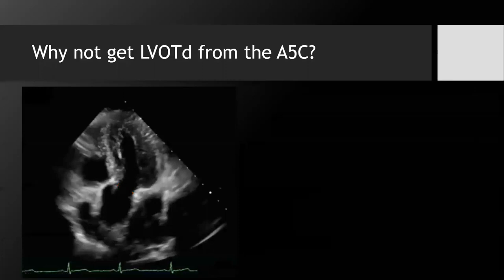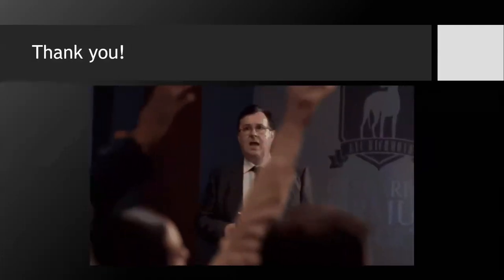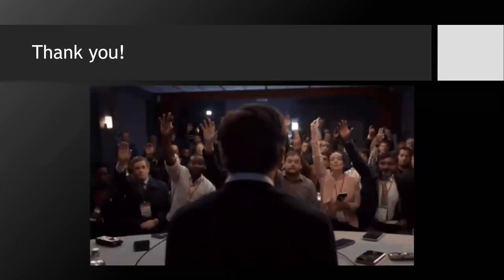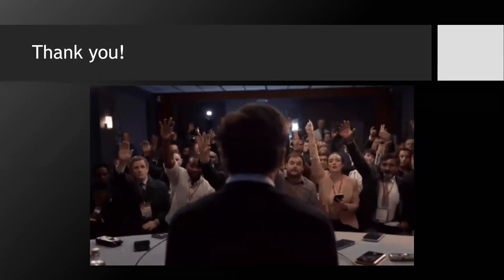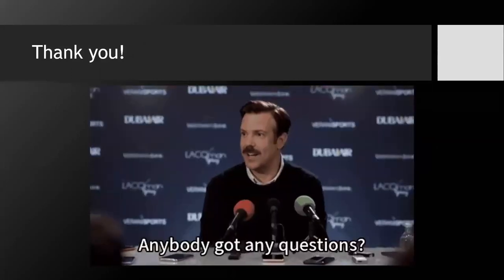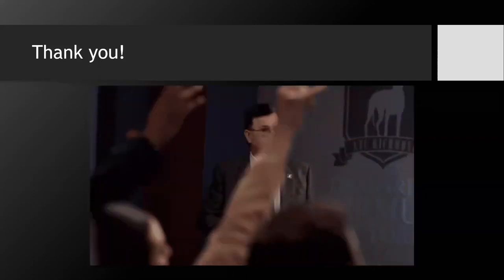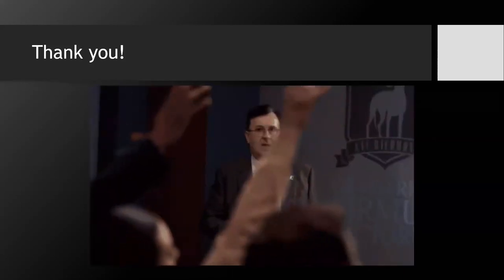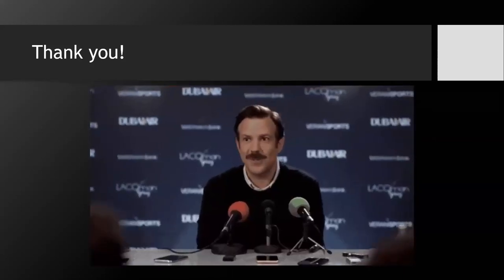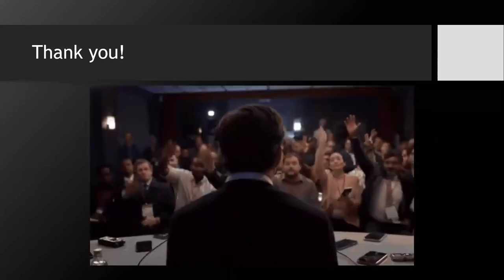Do you mind if I ask one more question? Yeah, sure, please. Thank you. So just thinking about the flow, would you ever worry about laminar versus turbulent flow changing anything about your calculation? Even if that were true, at the leaflet insertion you should have laminar flow, because it would become more turbulent as it goes through the valve. And so you can trust the velocity calculations at that insertion site. Does that question make sense?